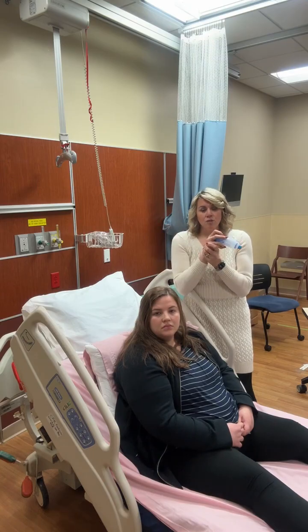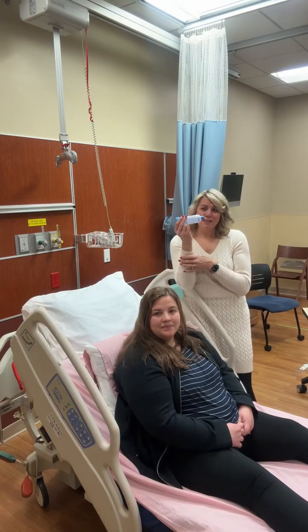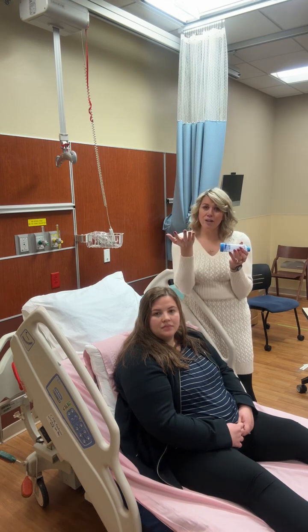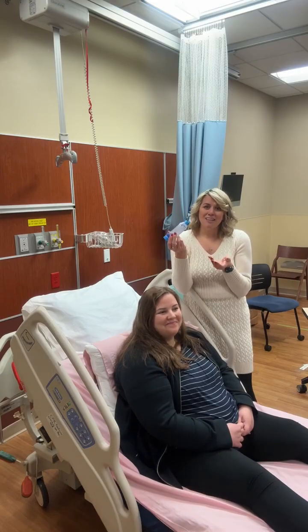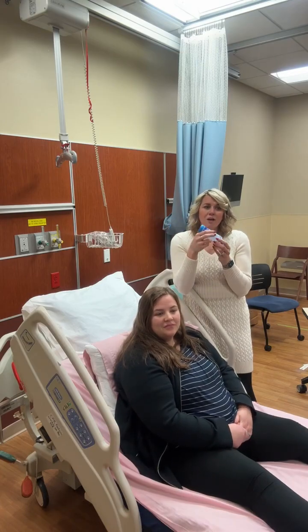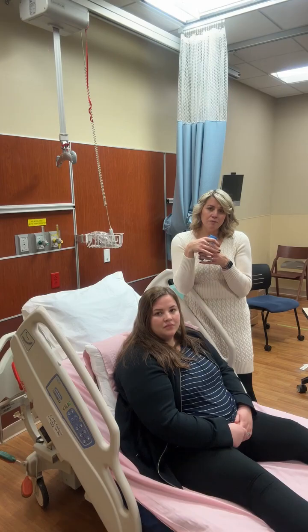Now, it does look horrific when an RT has to administer an inhaler with a masked spacer, because typically we have to put it over the baby's face, which scares them, and we do not remove the mask from the baby's face until they breathe in, which is when they're ready to scream in terror. Sometimes you might see these used with kids in the event that we can't get a nebulizer to them right away, but we do need to have some sort of a rescue medication on hand for them in the event that they're in respiratory distress.